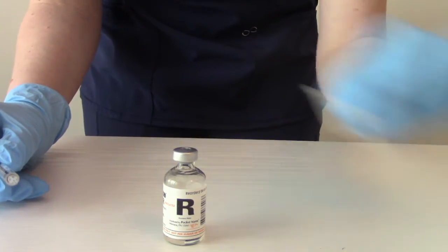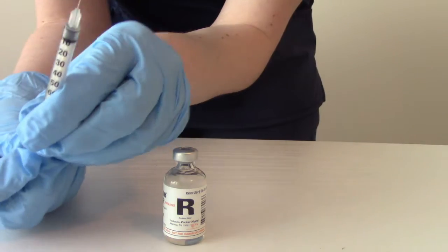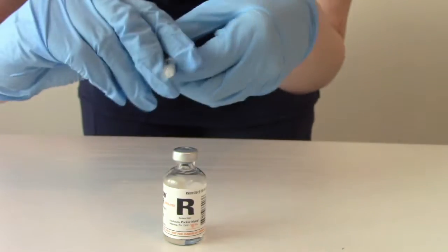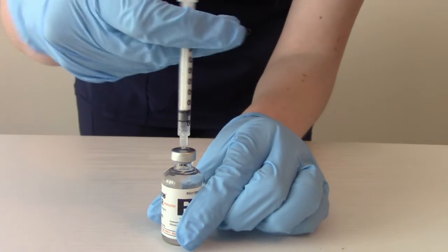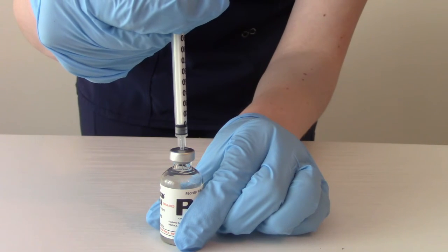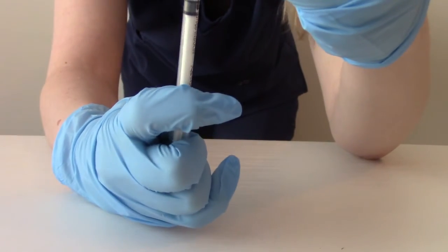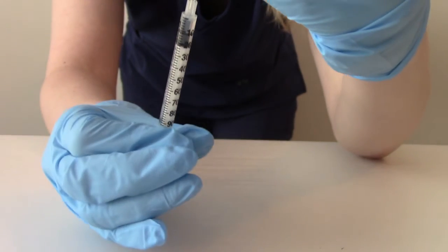So we're going to pop off our cap, alcohol it off, and then we're going to draw back 10 of air and inject it. You've got to be really careful with these insulin needles because they're so fragile. So we've injected it — now we're going to invert it and pull back. We put 10 in, we need to take 10 out. There we go, we have 10 out.